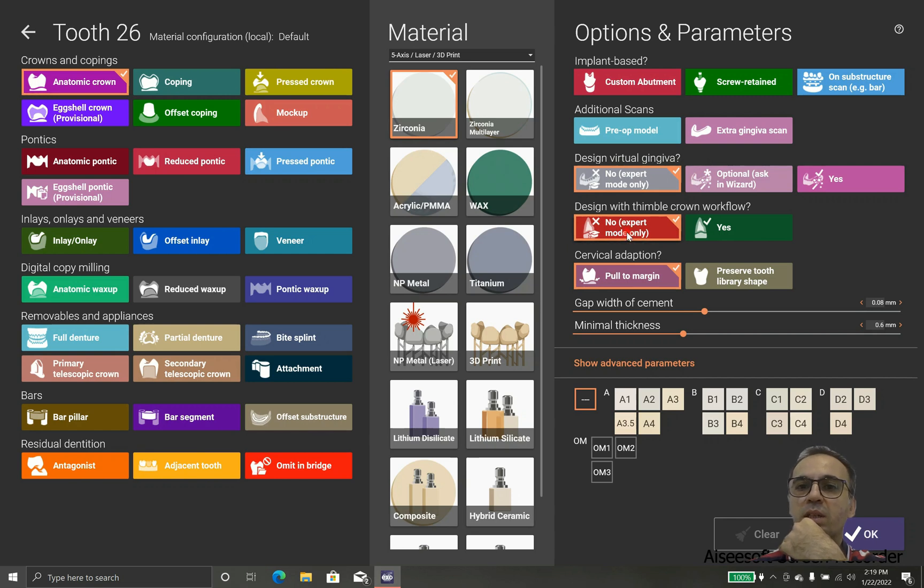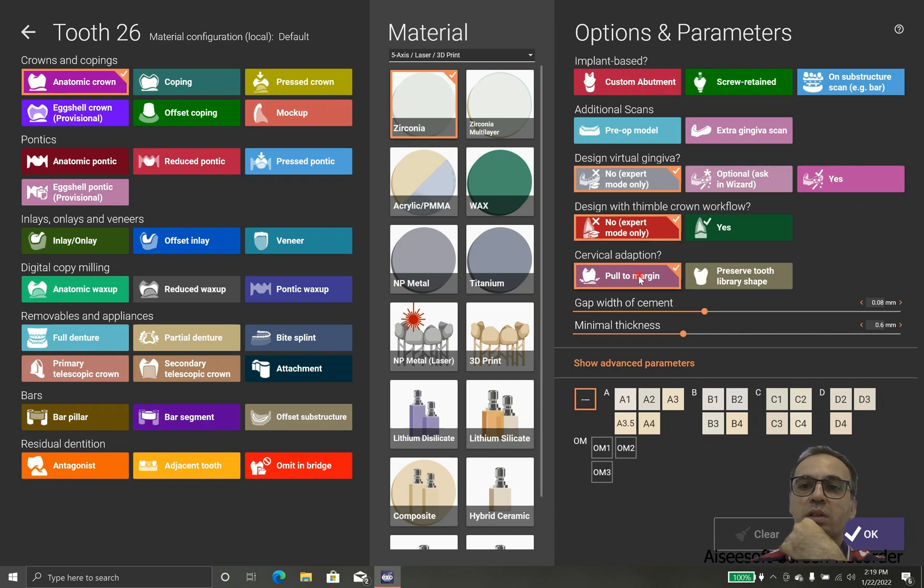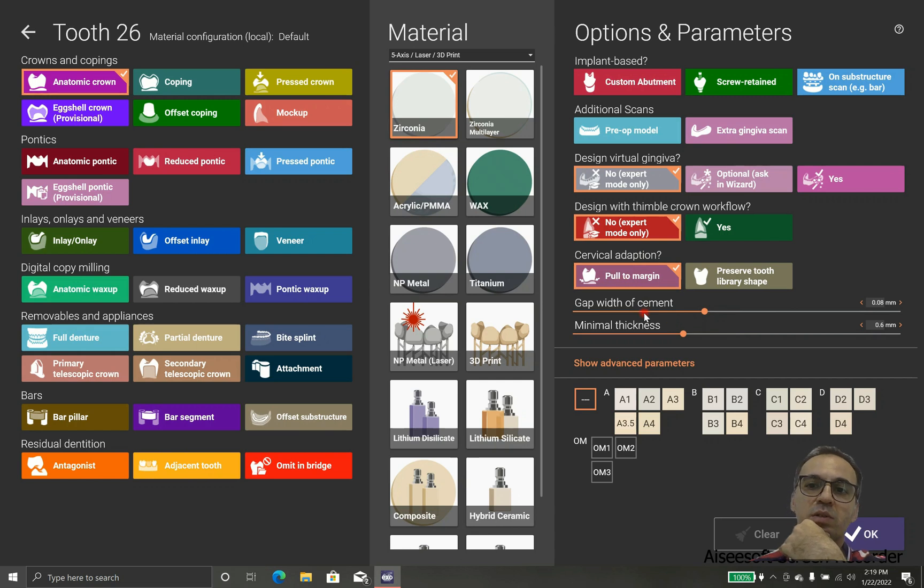In case that we have extra gingival scan or we want to use gingival design, we can check it right now.